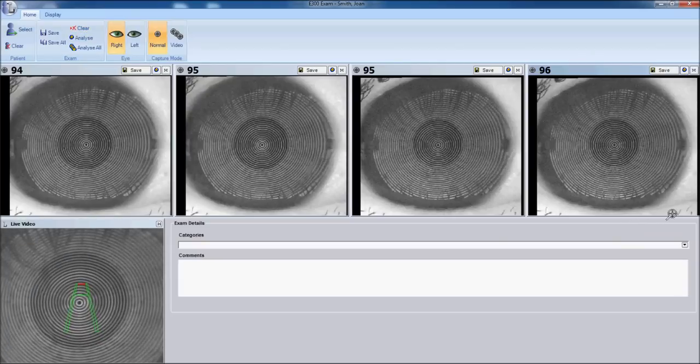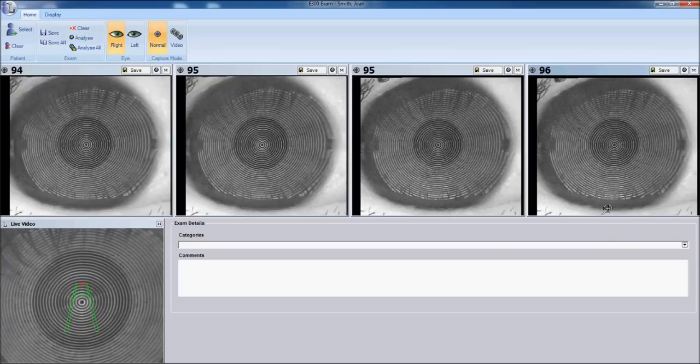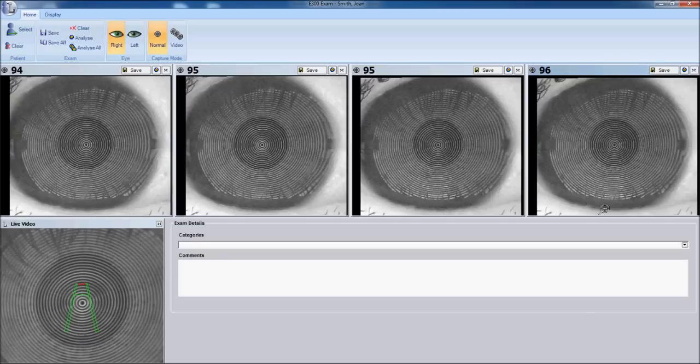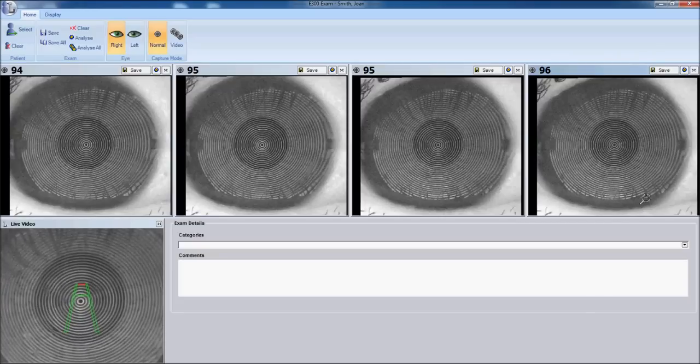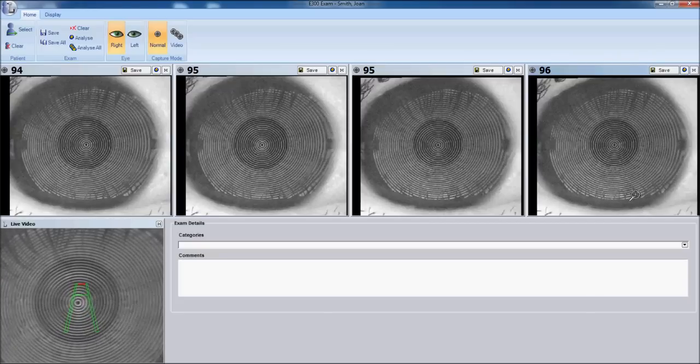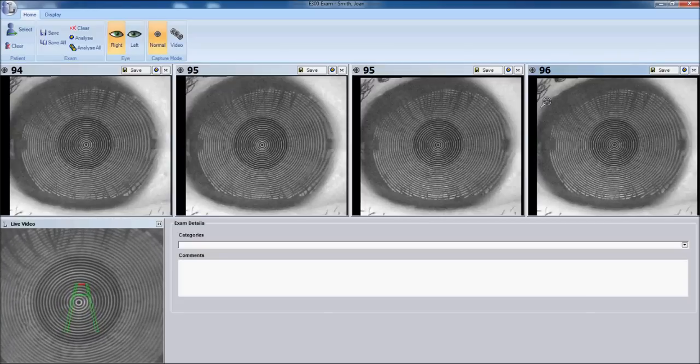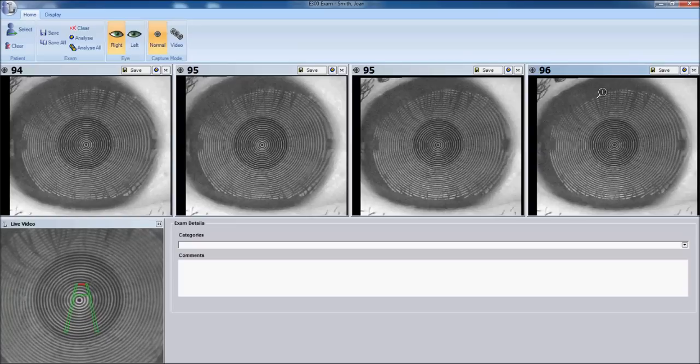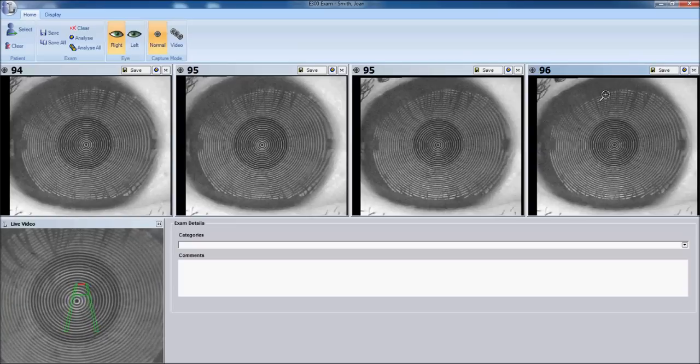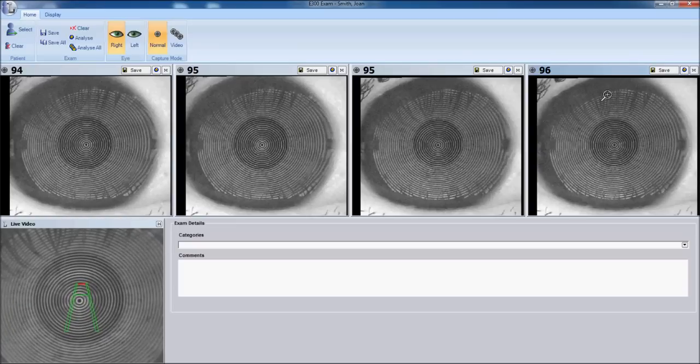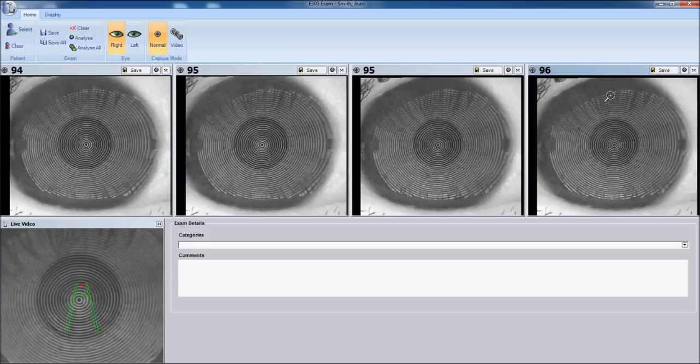By pulling down on the lower lid, you can move that lid off the cornea and get a little more inferior ring reflection. The upper lid you can't pull back because the patient must maintain normal blink and normal refreshing of tear layer.